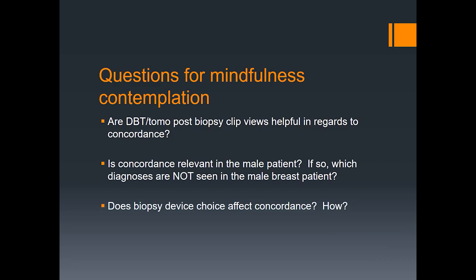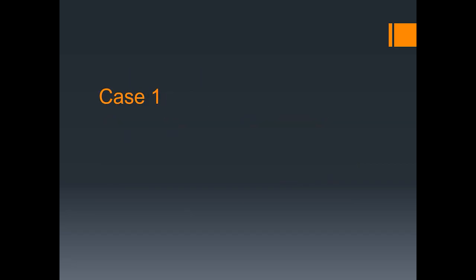Does biopsy device choice affect concordance? And I think we know the answer to that, but we always have to think about how that might be in the reality of a patient and following longitudinally. We'll discuss these in terms of cases, as I believe that cases probably best enable us to consider radiology and pathology correlation. This topic is particularly amenable to case presentation.